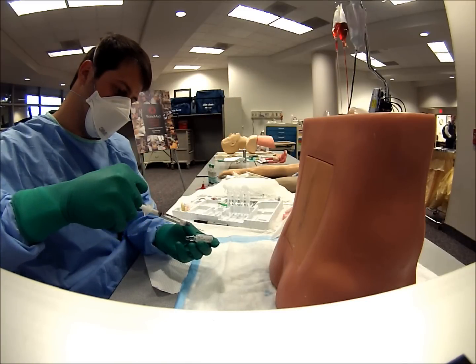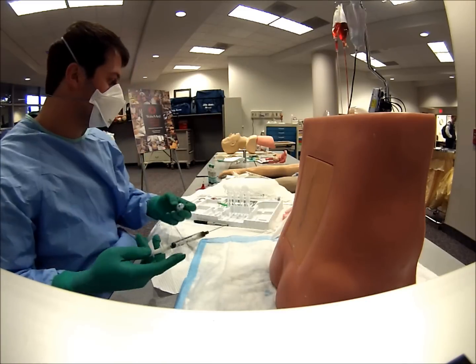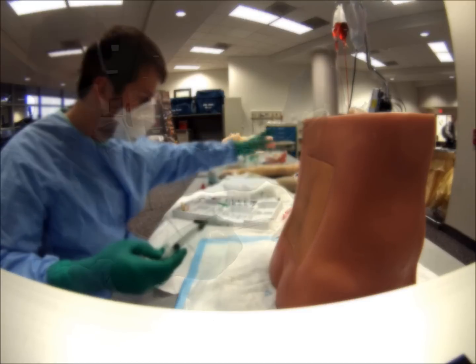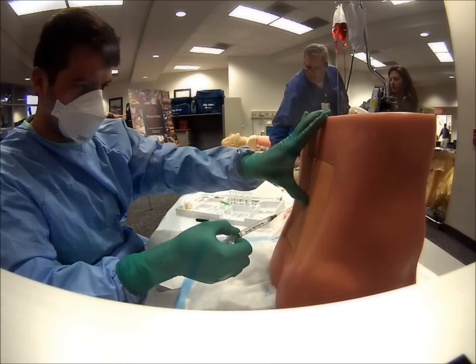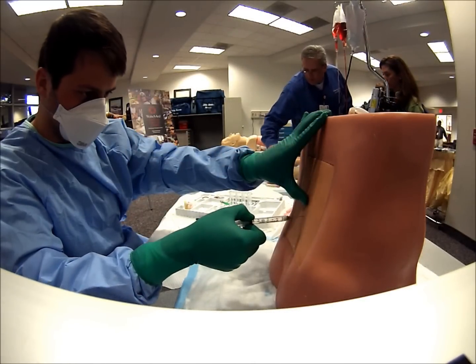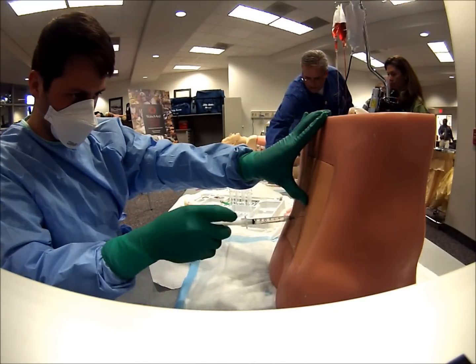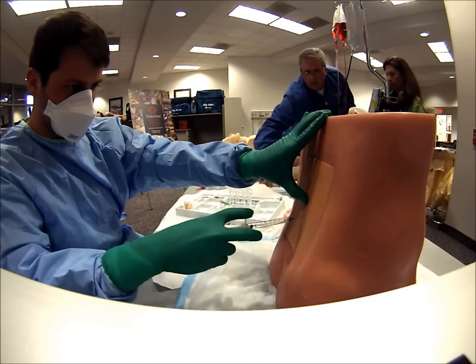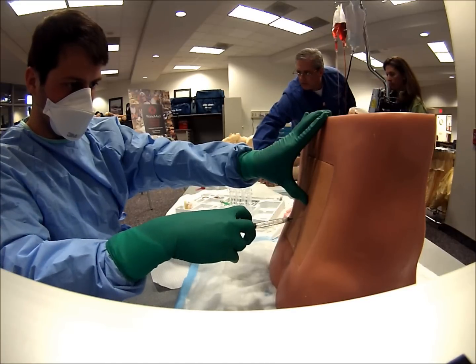We are now going to draw up the local anesthesia, which is lidocaine in this case, out of a glass ampoule with a filter tip needle. For simulation's sake, we don't have a sharps container or an exchange needle before entering the patient.